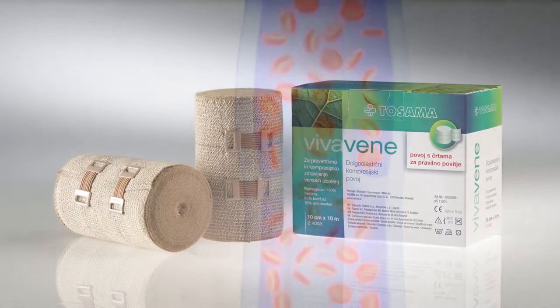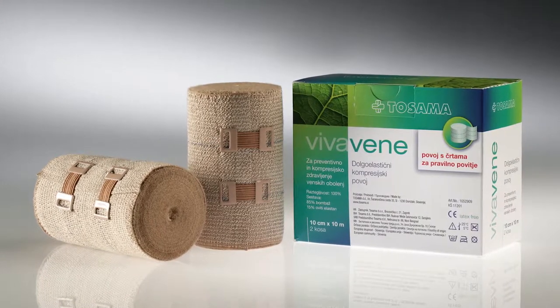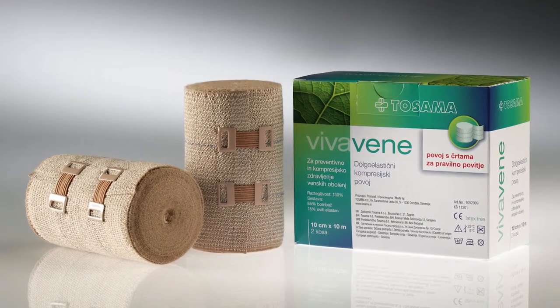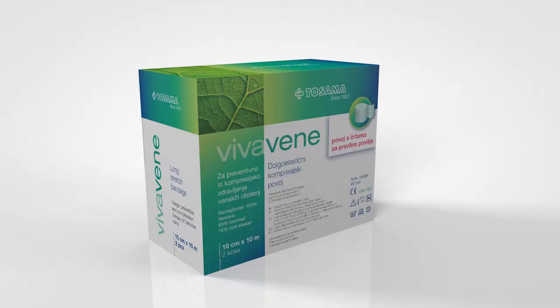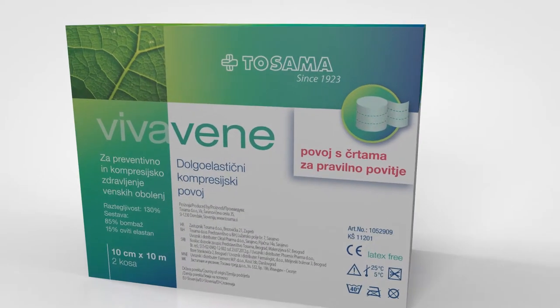Tightening or swelling under bandages means that the wrapping was not correct. If this happens, repeat the wrapping process. Or it may mean that the bandage is old — in this case, discard the bandage and use a new one.